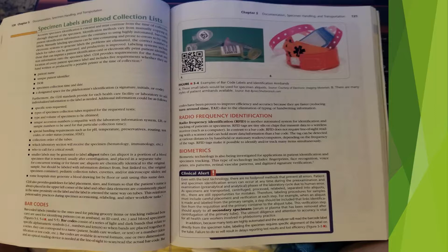The utmost diligence and attention to accuracy is vital for all healthcare workers involved in phlebotomy practice. In addition, because many tests are highly automated and the analyzer will read the barcode label directly from the specimen tube, labeling the specimen requires specific alignment of the label on the tube. Failure to do so will result in delays reporting test results and loss of efficiency. See Figure 5.5.